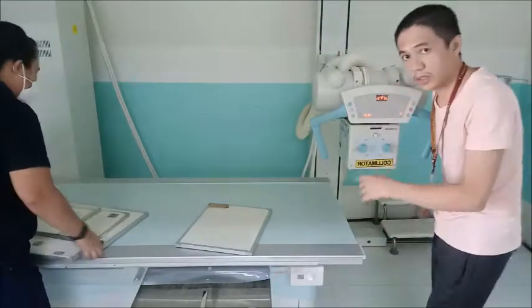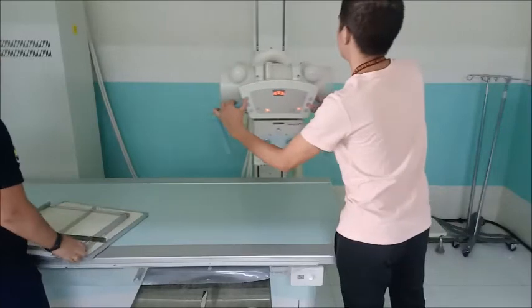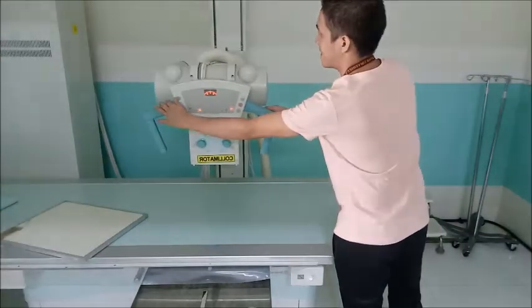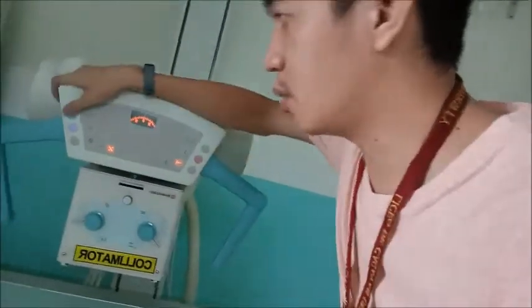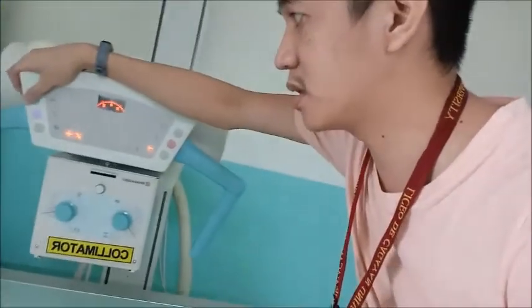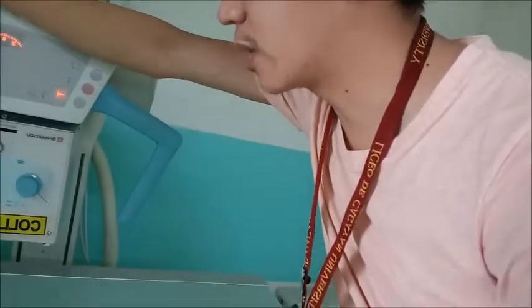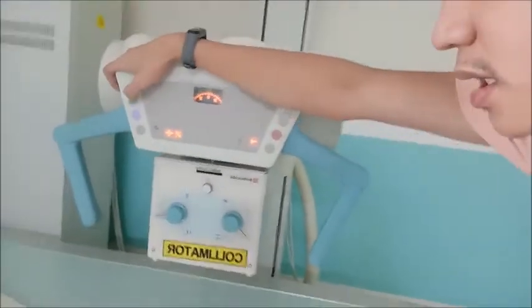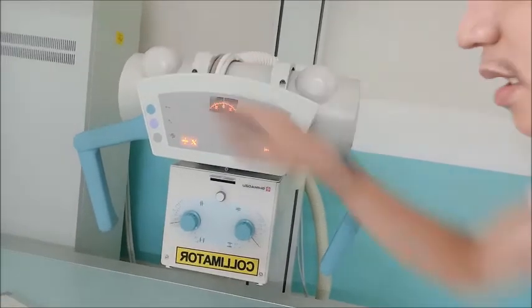The table and the tube are already perpendicular to each other. Earlier, that was the 72 SID, 72 inches SID towards the chest stand.